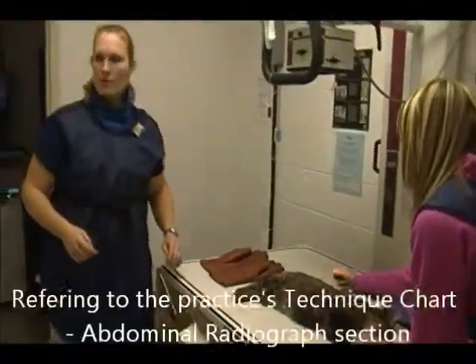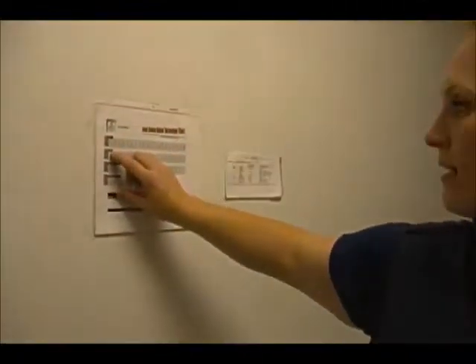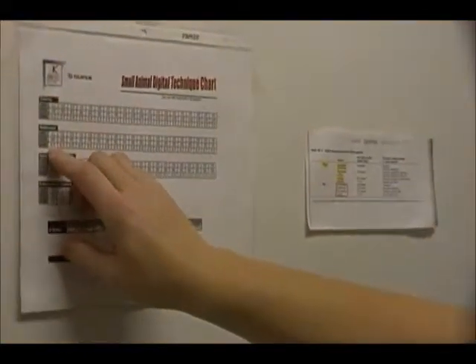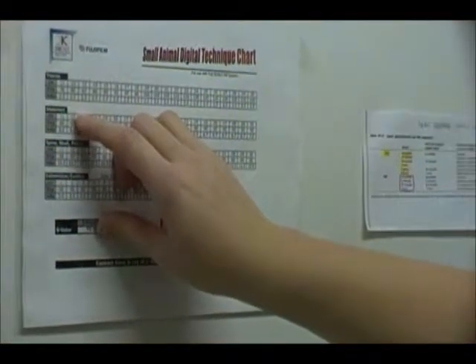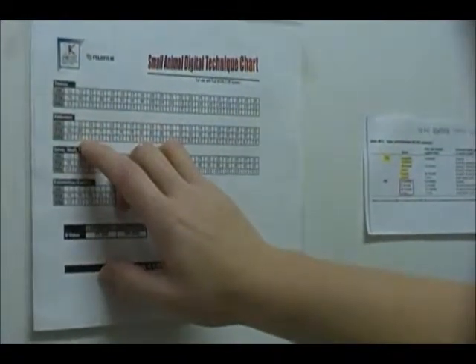So we're going to refer to our technique chart here. 11 cm is 66 kVp and 6.0 mAs, and the abdominal region for 12 cm is 68 kVp and 6.0 mAs.